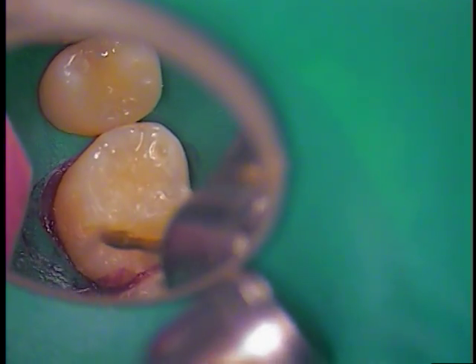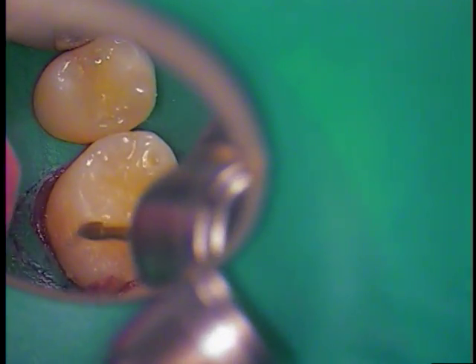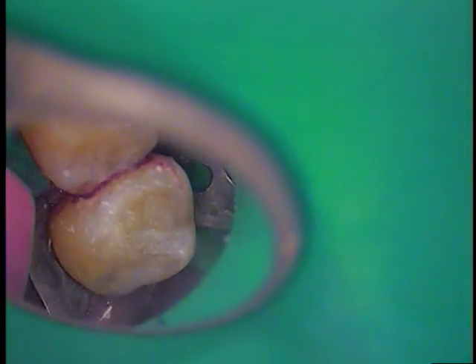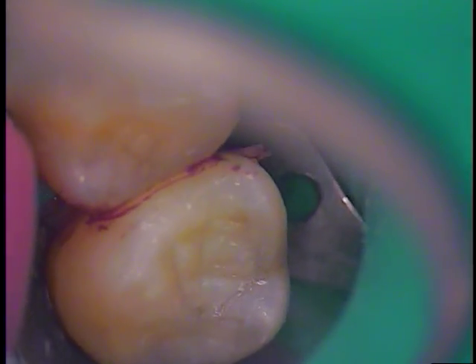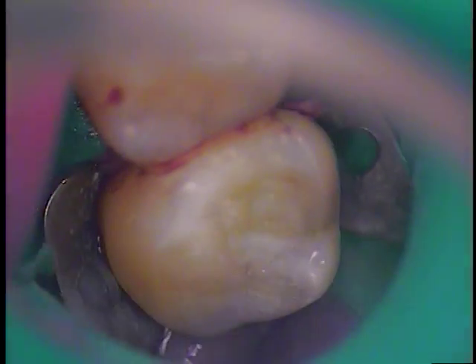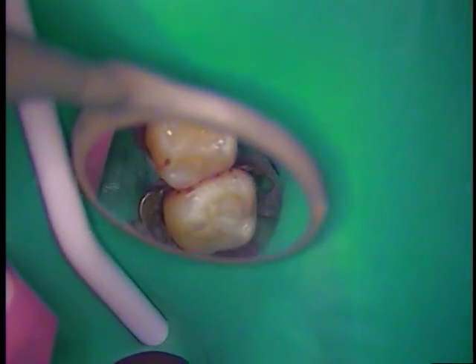Coming down the lingual side, let's get rid of a little bit of this excess composite. You could take a scaler and scale the occlusal - whatever you want to do. I'm going to finish up with some nice polishing, we'll check the occlusion. The anatomy is not bad - I kind of like it. Got some nice contours, and we'll move on to the next step - pop off the rubber dam.